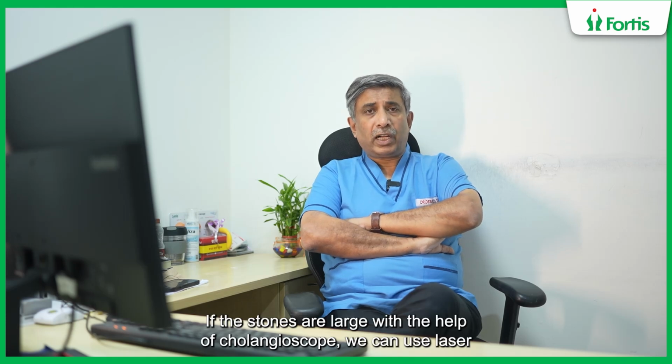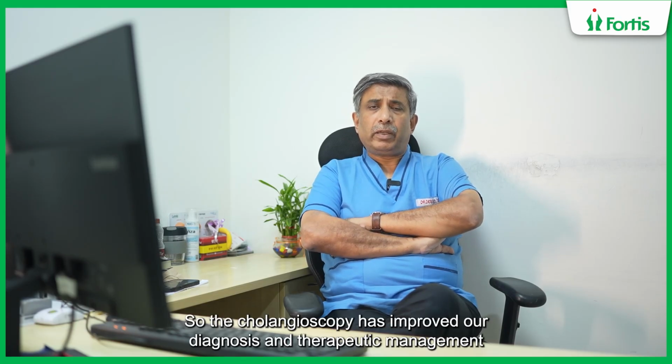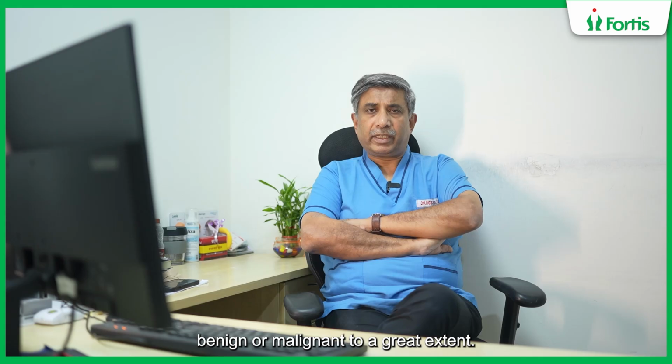If the stones are large, with the help of the cholangioscope, we can use laser to crush the stone and take the stone out subsequently by ERCP. So cholangioscopy has improved our diagnostic and therapeutic management of common bile duct stones and common bile duct strictures, whether benign or malignant, to a great extent.